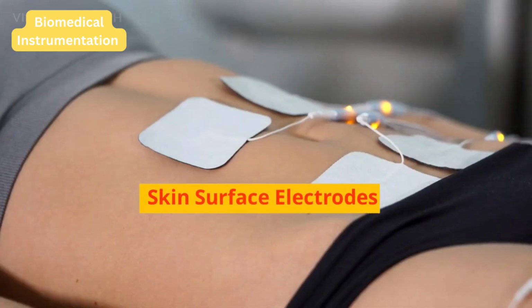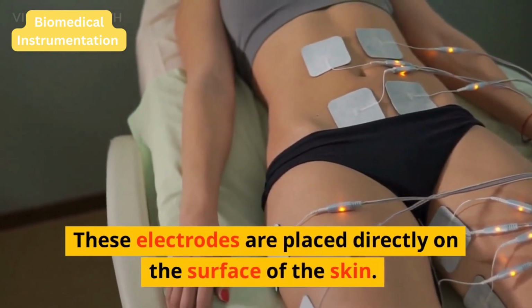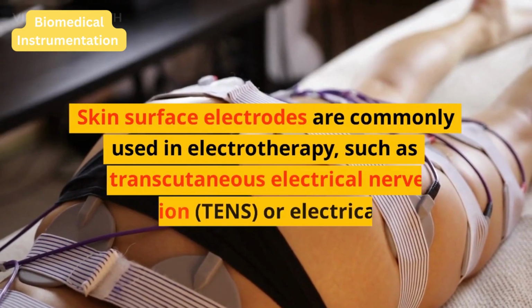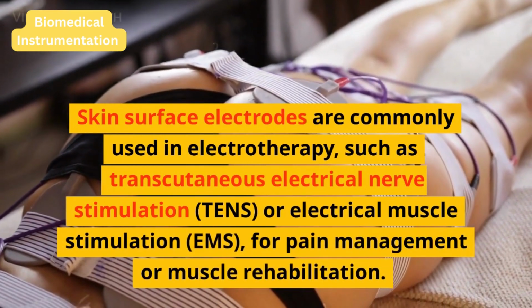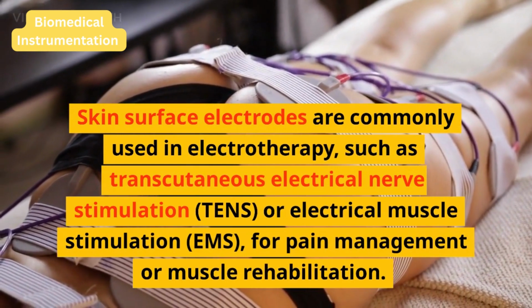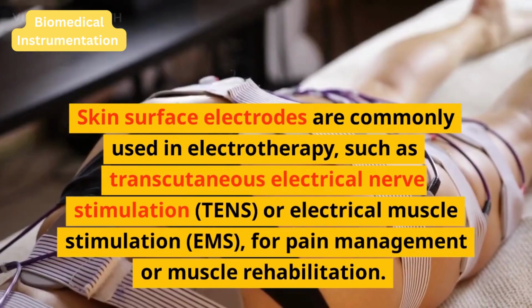Skin surface electrodes. These electrodes are placed directly on the surface of the skin. Skin surface electrodes are commonly used in electrotherapy, such as transcutaneous electrical nerve stimulation, TENS, or electrical muscle stimulation, EMS, for pain management or muscle rehabilitation.